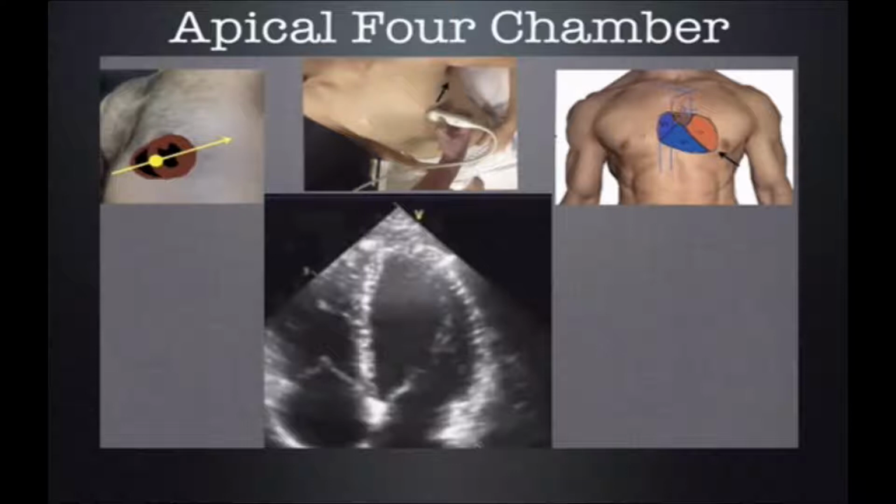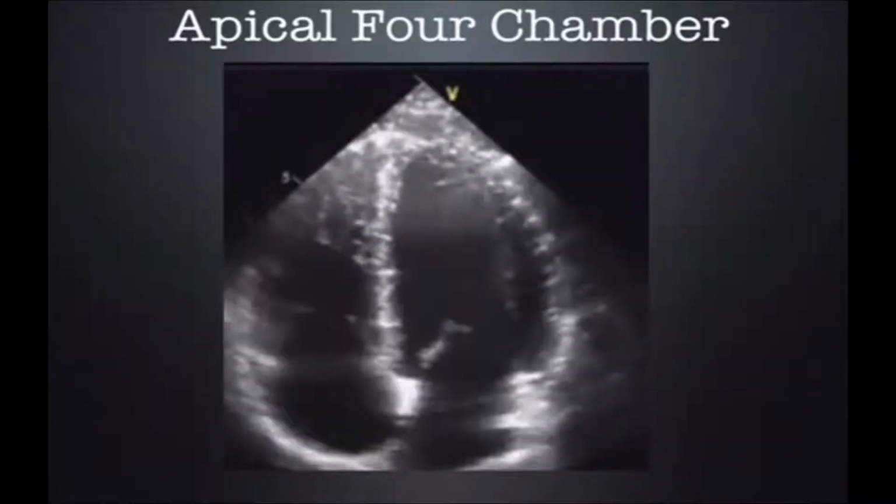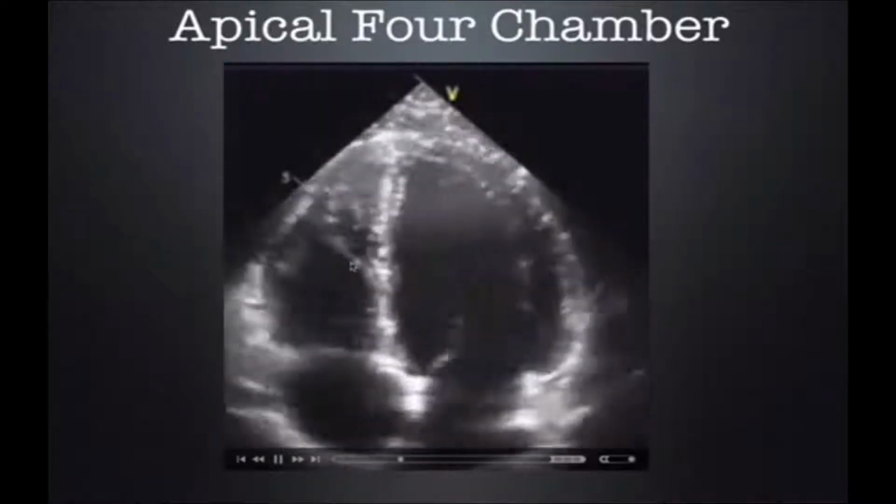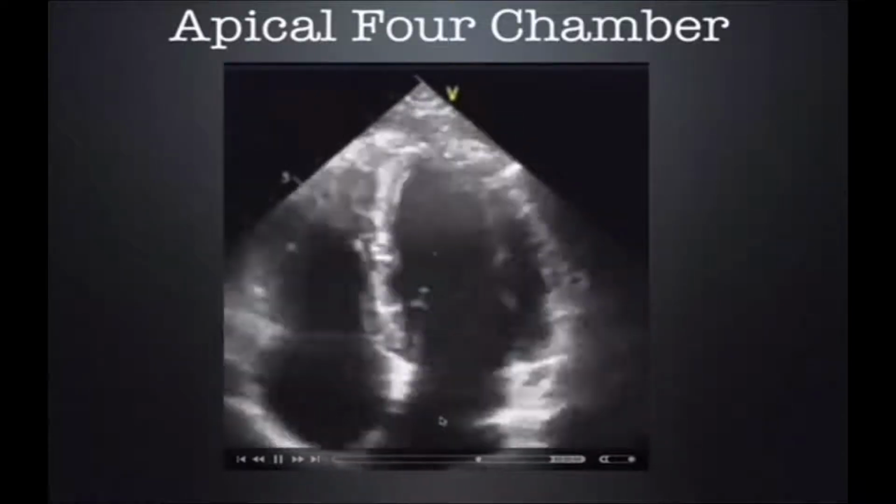Next view I like to use is the apical 4-chamber view, and this is how you obtain the 4-chamber view. The probe is placed just below the left nipple with the indicator pointing somewhere between the bed and the patient's left axilla. If you look at it from this angle, you'll see the sound beam intersects the ventricles in this orientation, so you get a nice view of the right ventricle and the left ventricle. This would be the right atrium, and this is the left atrium. This would be the mitral valve here, and here's the tricuspid valve. This is the view that you should get. Again, left ventricle, right atrium, left atrium.